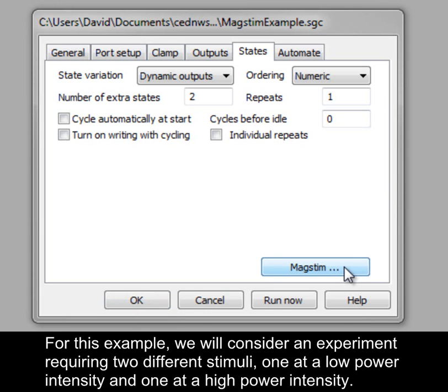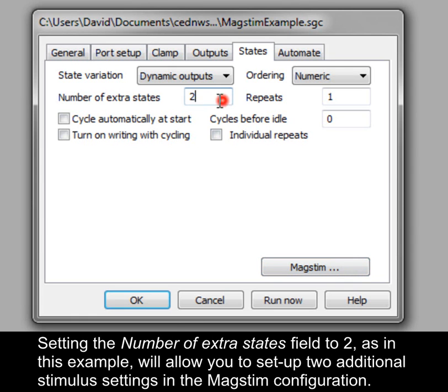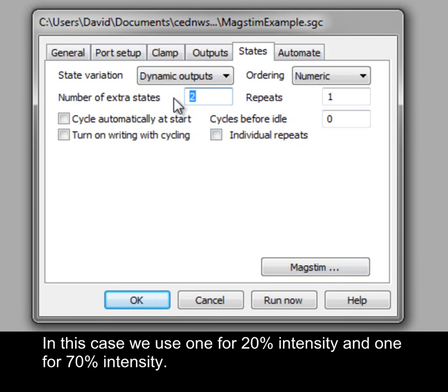For this example, we will consider an experiment requiring two different stimuli: one at a low power intensity and one at a high power intensity. Setting the number of extra states field to 2, as in this example, will allow you to set up two additional stimulus settings in the MagStim configuration. In this case, we use one for 20% intensity and one for 70% intensity.